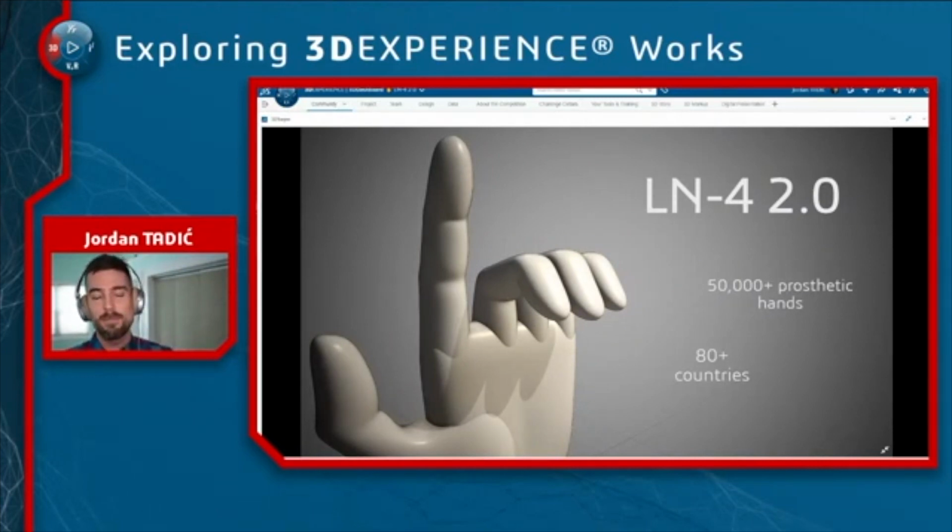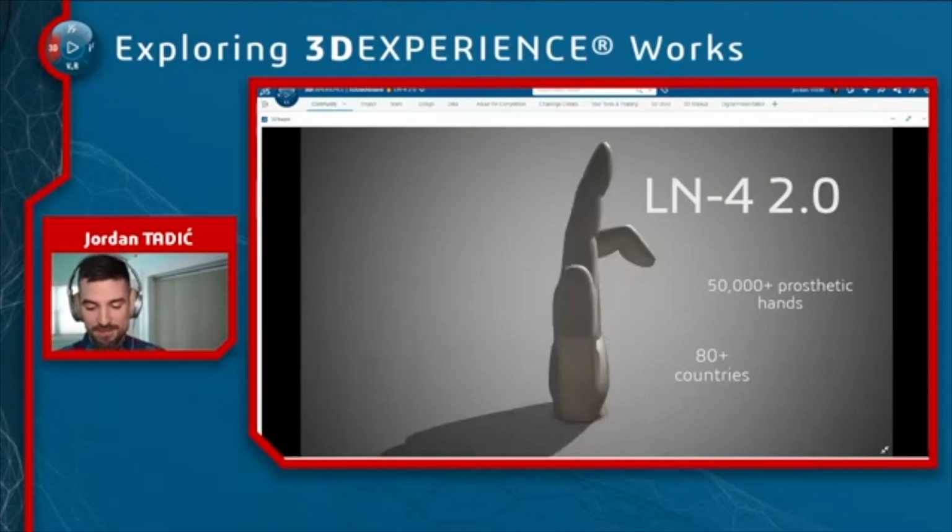So it's an amazing cause. It's filled with a ton of really, really kind and generous people and volunteers worldwide distributing these prosthetic hands. So we are currently working on the redesign. Our team won that little hackathon, and now we're maybe about a year away from actually mass producing the second version of this. So what I want to show you today is how we got started on this design.